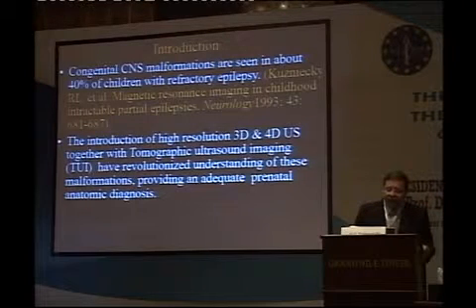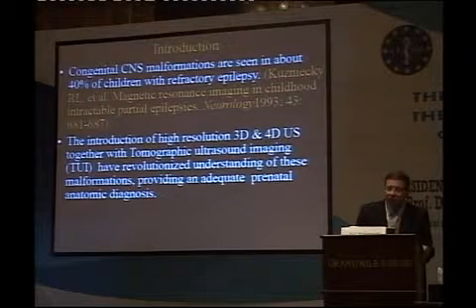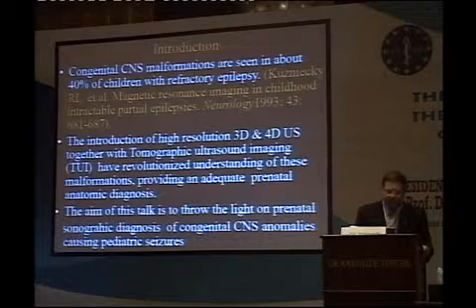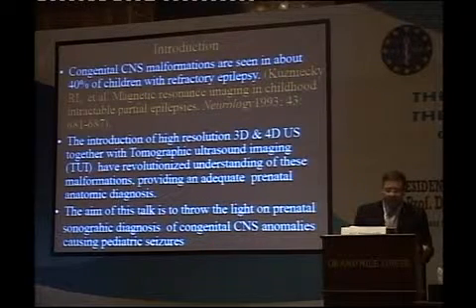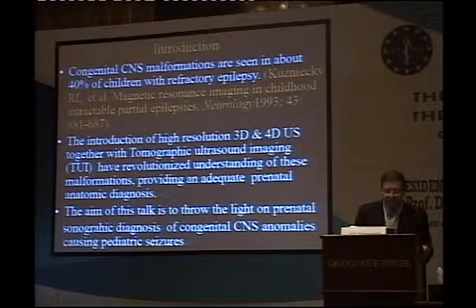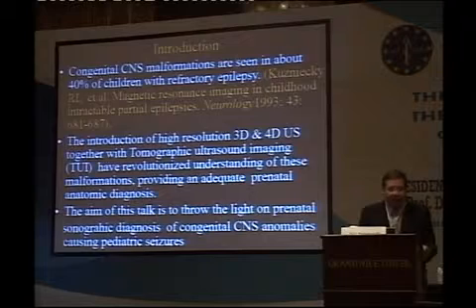The introduction of high-resolution 3D and 4D ultrasound, together with tomographic ultrasound imaging, has revolutionized understanding of these malformations, providing an adequate prenatal anatomical diagnosis. The aim of this talk is to throw light on prenatal sonographic diagnosis of congenital CNS anomalies causing pediatric seizures and their clinical implications.